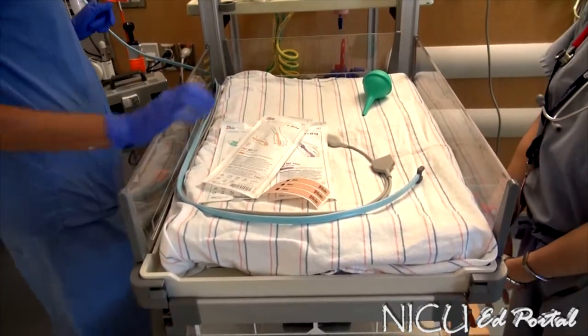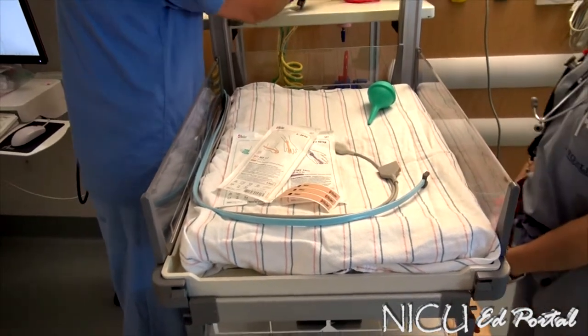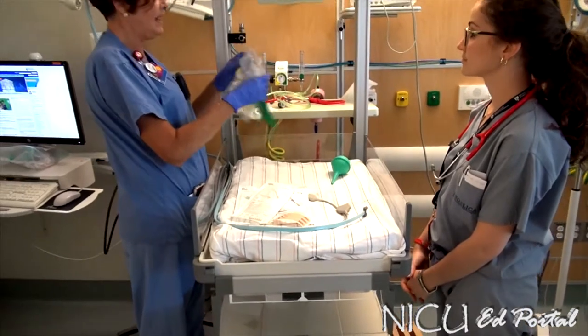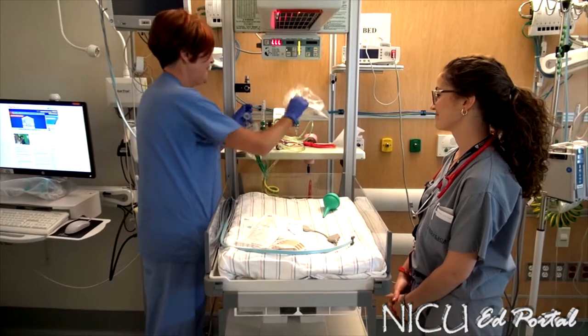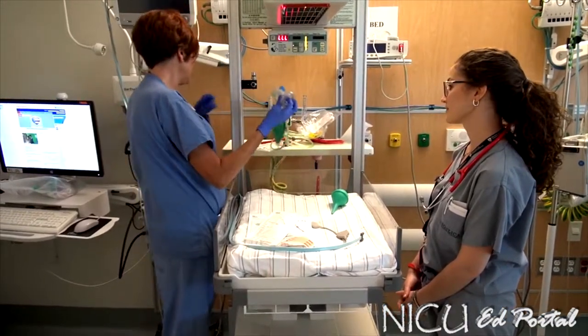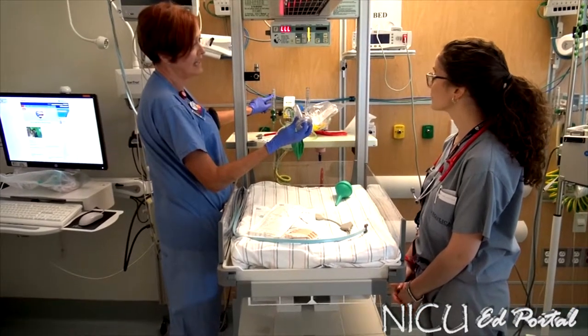The other thing that you will need is oxygen. Make sure that your baby will have access to oxygen if they need it. Here is our bag. I'm going to practice giving a little bit of CPAP as well. Turn your oxygen on — it will always be up to 10 liters.